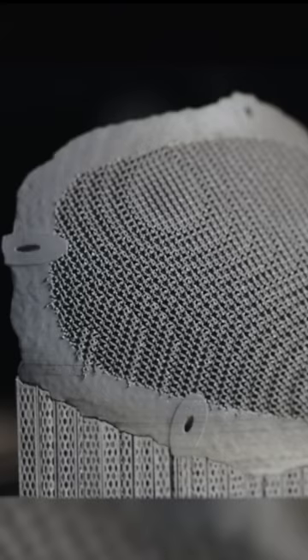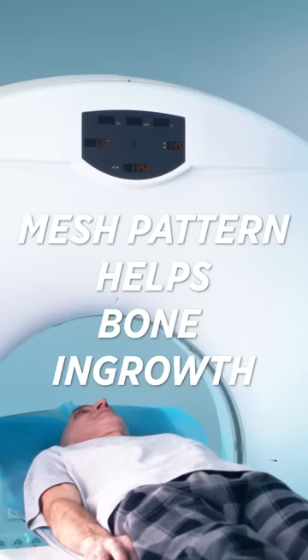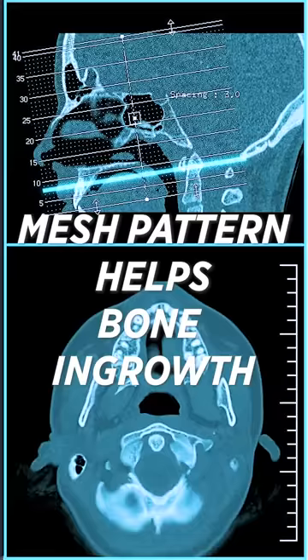Now the reason they're different is because the lattice structures are actually overlaying each other. And doctors have found that that helps promote bone ingrowth after the surgery. Now that mesh pattern really doesn't add any additional manufacturing cost — it's very easy to print that pattern using metal 3D printing. It's absolutely incredible that 3D printing is able to help solve this problem.